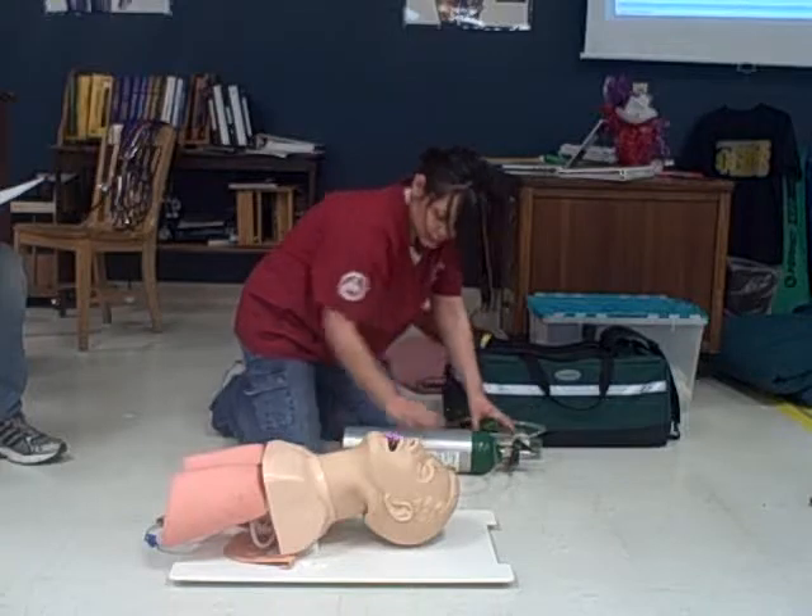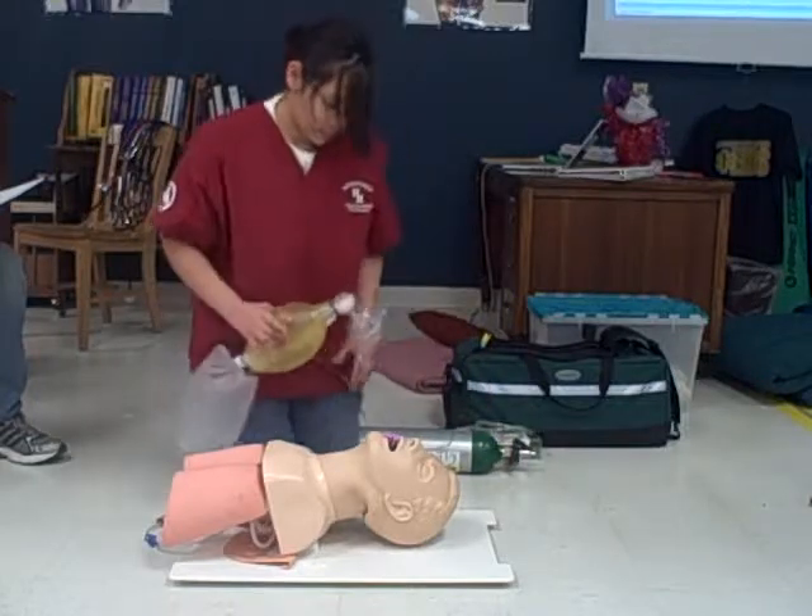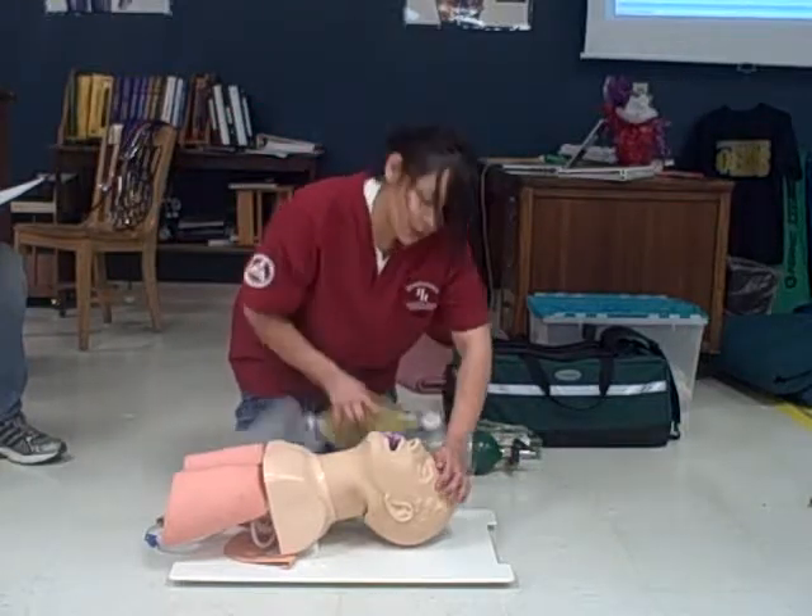I'll continue with my ventilations after I do another head-tilt, chin-lift to open up the airway again.